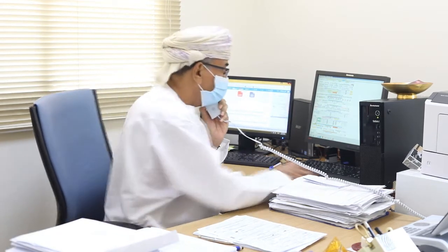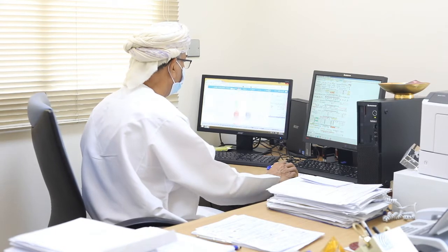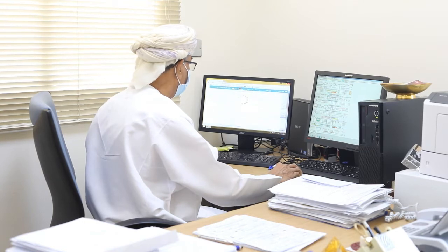What is KT/V? KT/V is the most widely used dialysis parameter to assess the dialysis dose. It is a measurement of the efficacy of a hemodialysis session. It identifies the effective removal of a specific solute resulting from a given treatment in a given patient. It also compares the amount of fluid that passes through the dialyzer with the total amount of fluid in the patient. It is more accurate than urea reduction rate in measuring the amount of urea removed during dialysis.